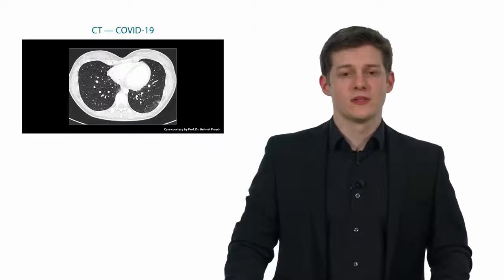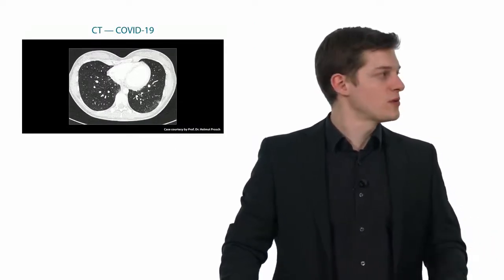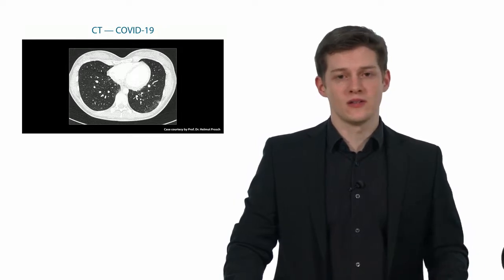But we do know that patients can have myocardial infarctions. We know that there have been patients described with arrhythmias, and that we also can see myocarditis. And I've been in touch with some colleagues who've mentioned that right heart myocarditis is one big concern. Let's take a look at two cases Professor Prosch shared in the webinar of Sonography about COVID-19.